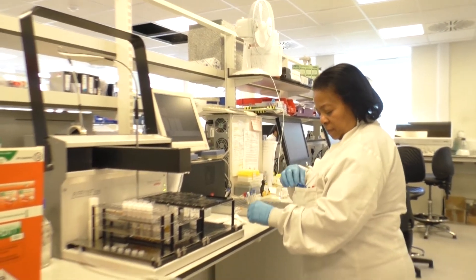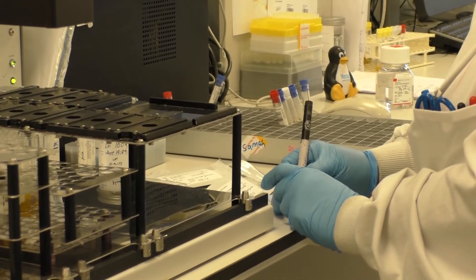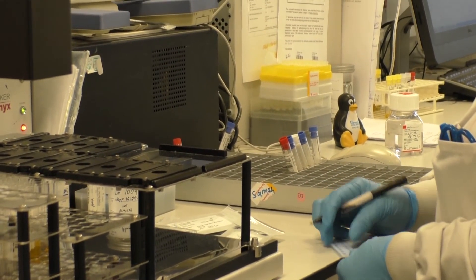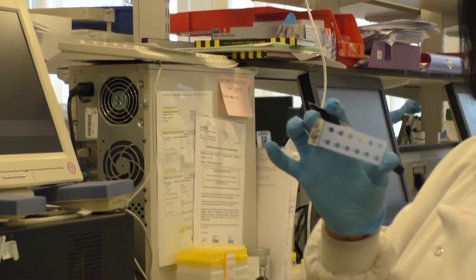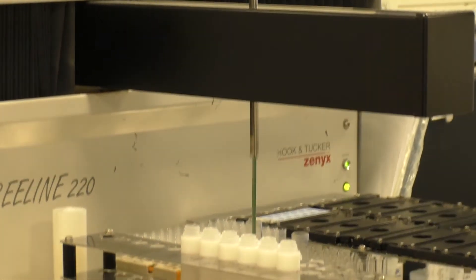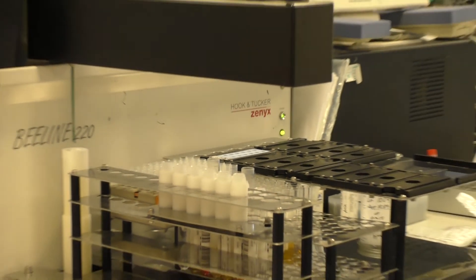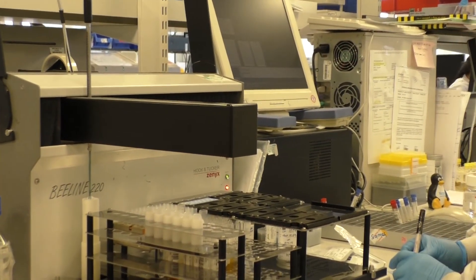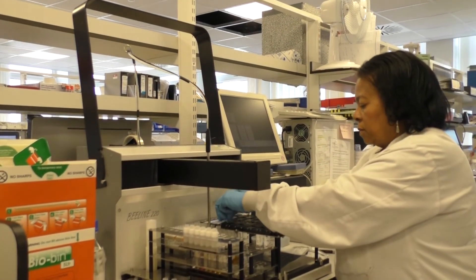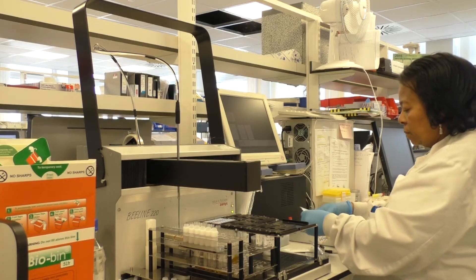The slides are then labelled with the dates and the slide number, and they're put in a slide tray where the machine will transfer the diluted patient sample into the correct position on the slide tray. The machine is calibrated so that it knows which dilution tube corresponds to which well on the slide.